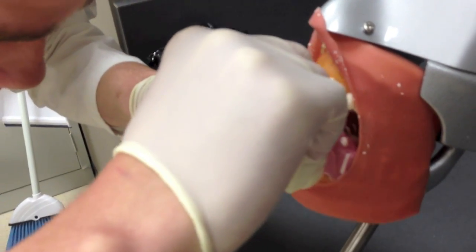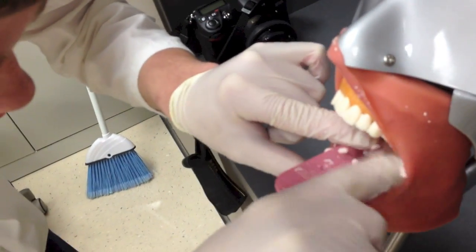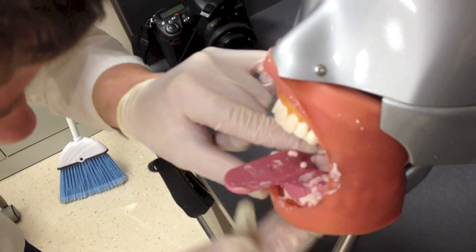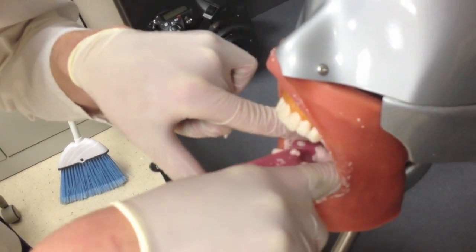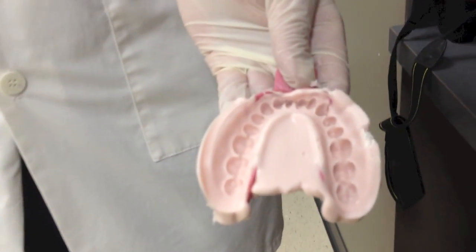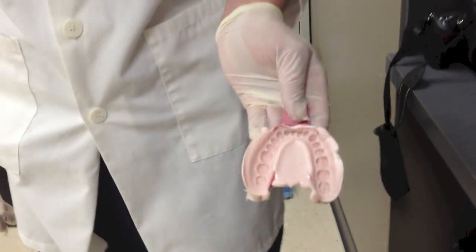When you're placing the impression tray in the patient's mouth, you want to start from the back and then work your way to the front. That way all the impression material is flowing towards the front, because you don't want the impression material to flow towards the back — they can gag and choke. You want to push down evenly on both sides so it has an even flow, and make sure the patient's lip is over top of it and the tongue is sticking over it, so it's an even feel.